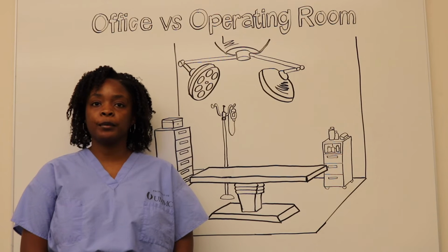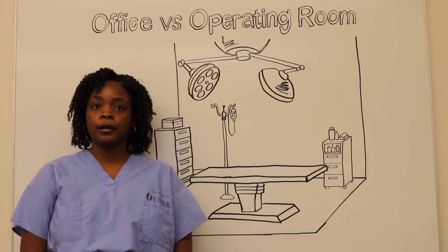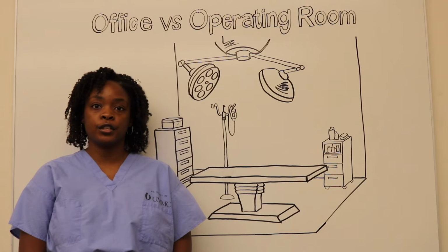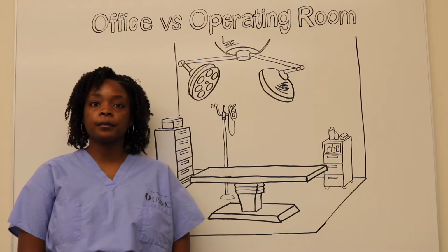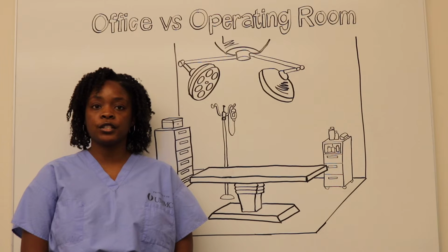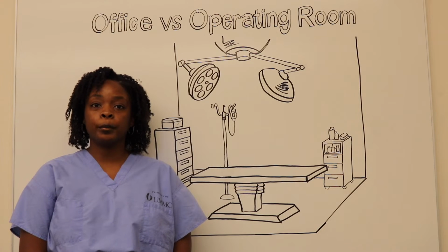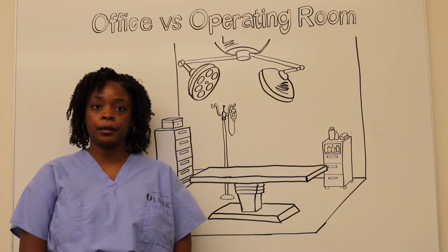Hysteroscopy can be performed in the office or in the operating room. Office-based hysteroscopy can be used for diagnostic purposes or for minor operative procedures, such as the treatment of small endometrial polyps. Hysteroscopy should be performed in the operating room for patients with cervical stenosis, significant uterine pathology, medical comorbidities, or previously failed or not tolerated office hysteroscopy.